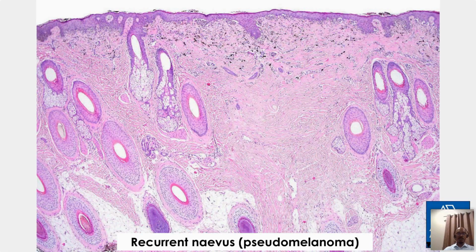And they're called pseudomelanoma because of the fact that they can actually look quite atypical. Sometimes you may even see severe atypia and isolated suprabasal melanocytes. But with one caveat, that before you actually call this type of lesion confidently a benign nevus, you have to review the previous histology to make sure that indeed what was excised here was just the nevus and not a melanoma, because melanoma would look the same.